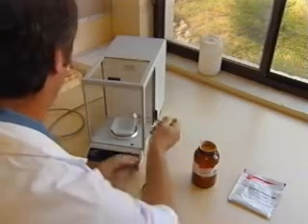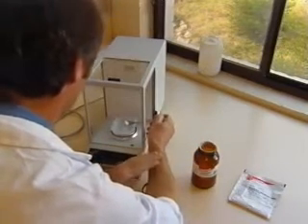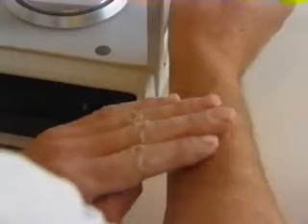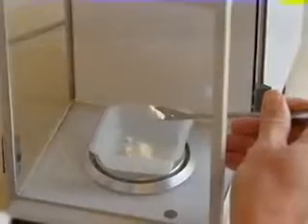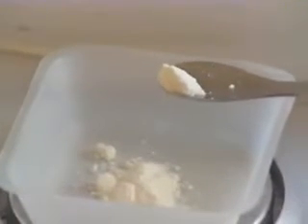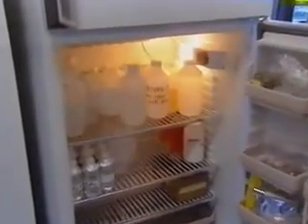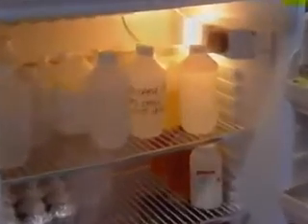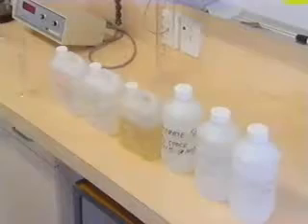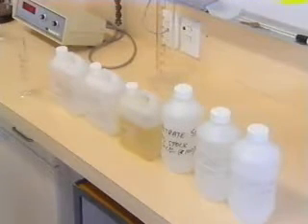Whilst this provides a lot of flexibility, it may work out to be a bit impractical for small labs. One needs to have all the chemicals and a sensitive balance to measure accurately the quantities required, a fridge to store the stock solutions, and suitable containers to store these stock solutions in. The final choice will very much depend on the quantities of the media you are preparing and the facilities in which you are working.